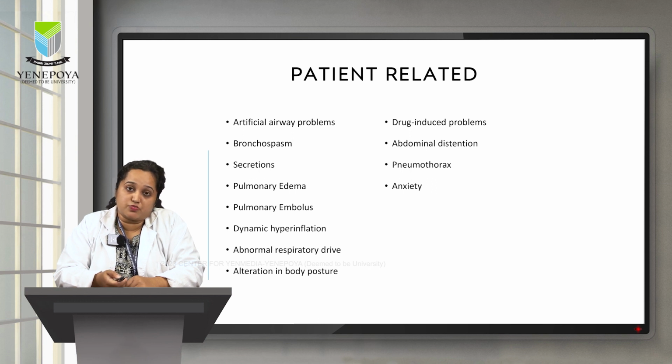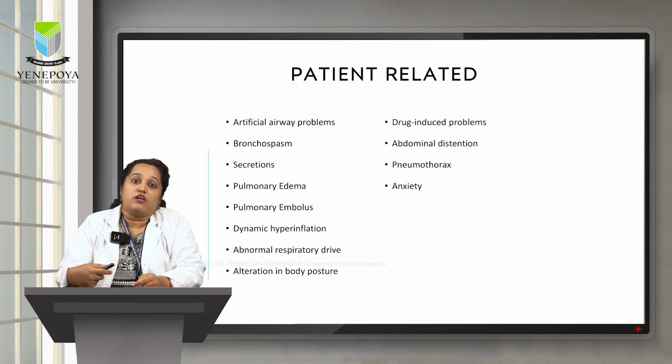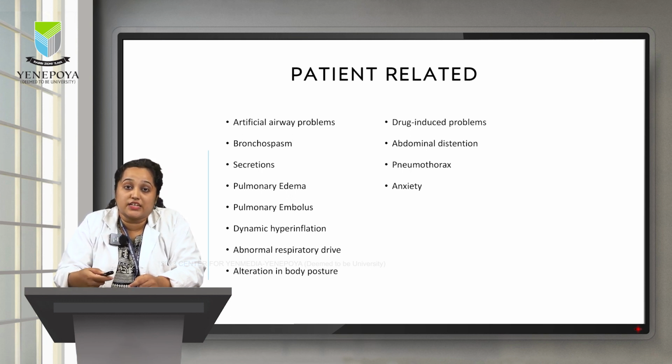And then drug induced problems, that is, if the patient was in sedation and apparently he was fine, comfortable on mechanical ventilation, but now the sedation has weaned off and the patient is again completely conscious and he is not able to resist whatever is happening, or he is not able to go in sync with the ventilation, that is, there will be asynchrony between the patient and the ventilator.